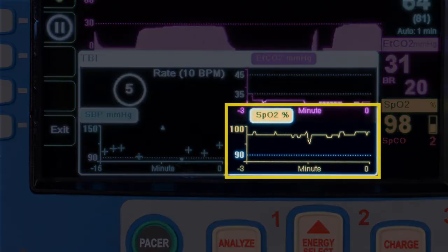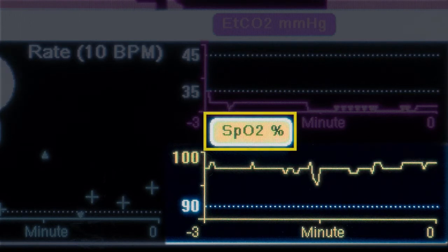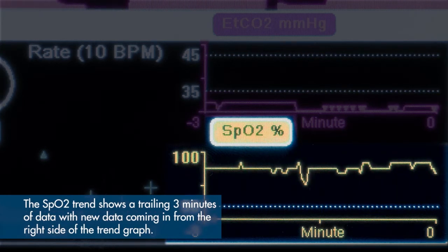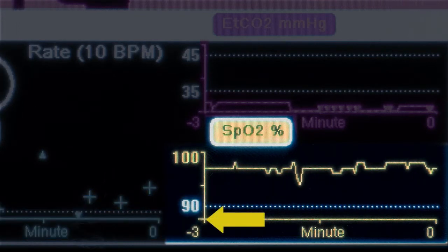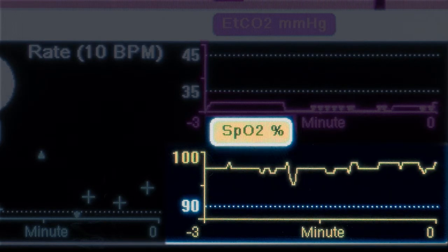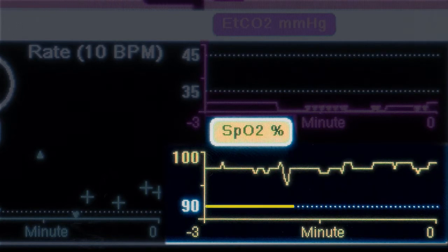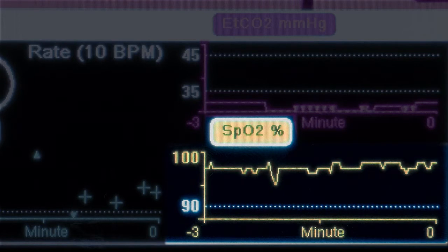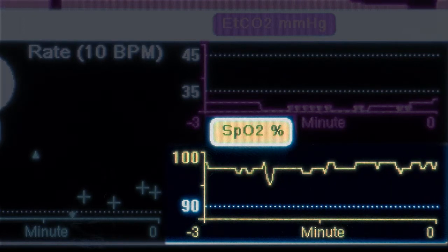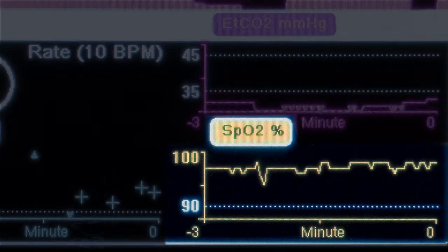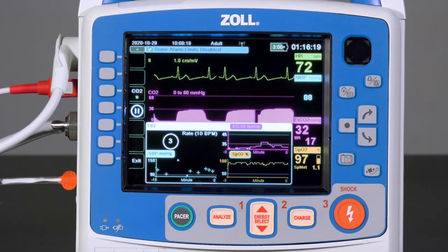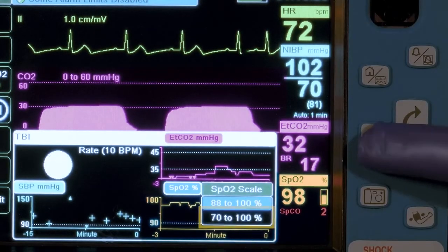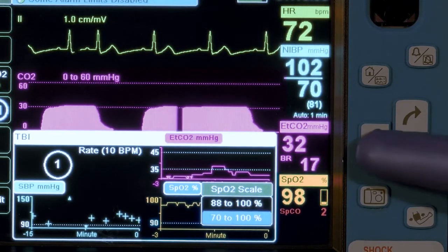Finally, we will cover the pulse oximetry, or SpO2, trend. The trend graph shows SpO2 percentage over time. The SpO2 trend shows a trailing 3 minutes of data, with new data coming in from the right side of the trend graph. The default viewable range is a low of 80% to a high of 100%. There is also a supervisor-configured low SpO2 limit, shown as a white dotted line on the graph, available only in adult patient mode. SpO2 data below the viewable range will be shown with an arrow pointing down at the bottom of the graph. It is possible to rescale the graph by highlighting SpO2%, pressing select, selecting the wider 70 to 100% setting, and pressing select again to confirm.